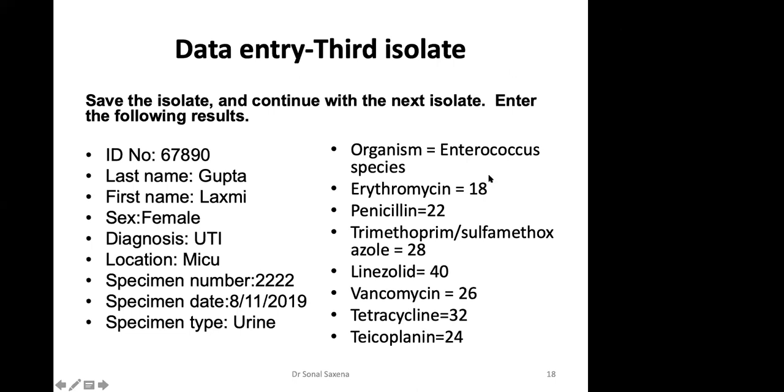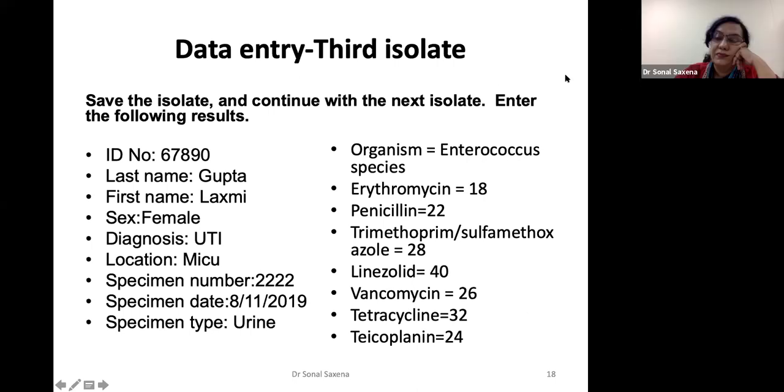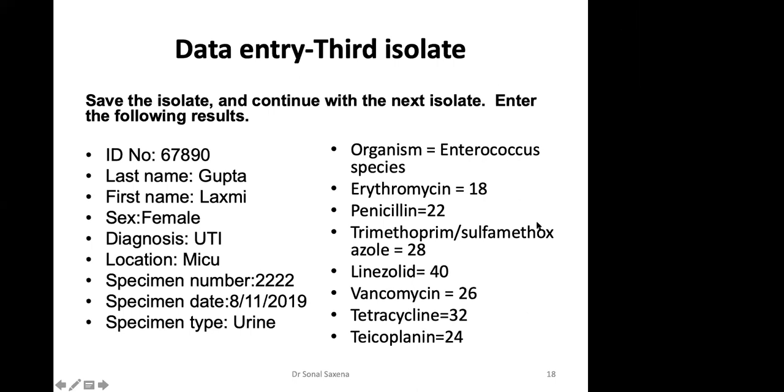Another very important thing, from the antimicrobial stewardship angle, is that depending on the MIC, there may be three or four antibiotics that are sensitive. But we could recommend to our clinical friends the one with the lower MIC, because then the PK/PD for that antibiotic works better: the Cmax over the MIC gives a much better concentration of antibiotic.